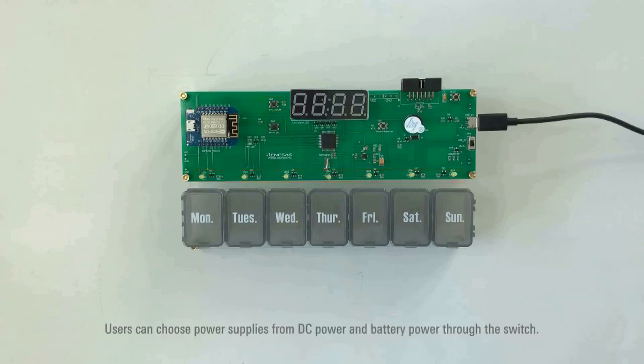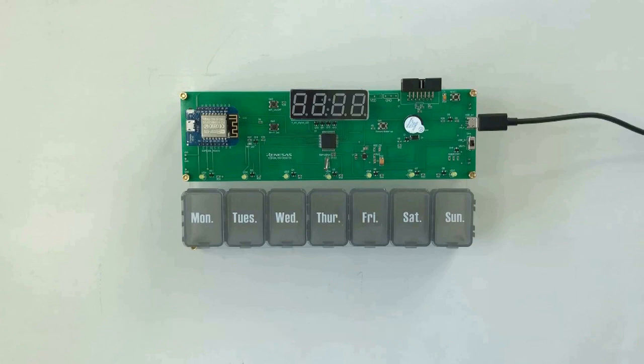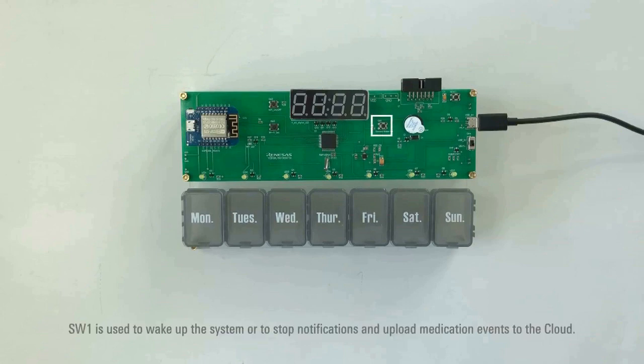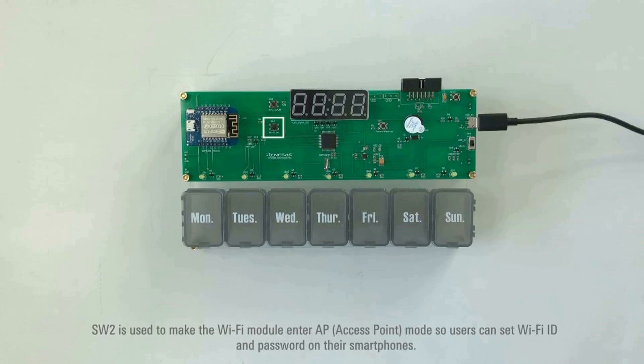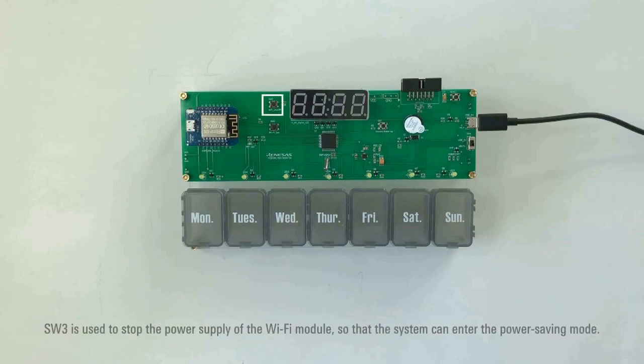Users can choose power supplies from DC power and battery power through the switch. SW1 is used to wake up the system or to stop notifications and upload medication events to the cloud. SW2 is used to make the Wi-Fi module enter AP mode so users can set Wi-Fi ID and password on their smartphones. SW3 is used to stop the power supply of the Wi-Fi module so that the system can enter power saving mode.